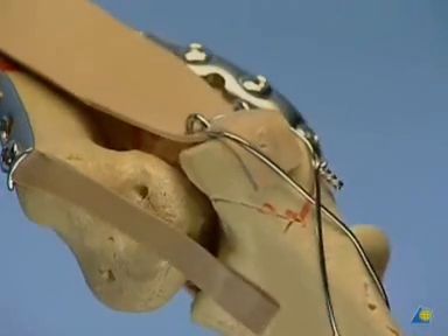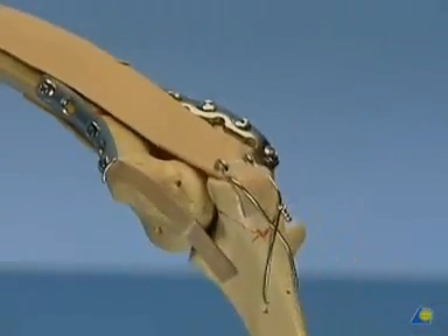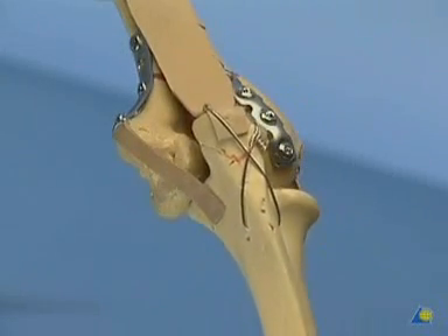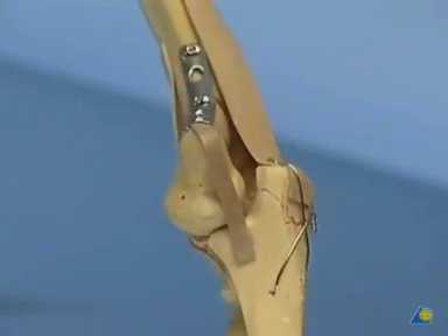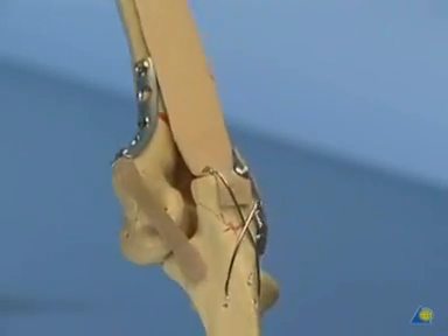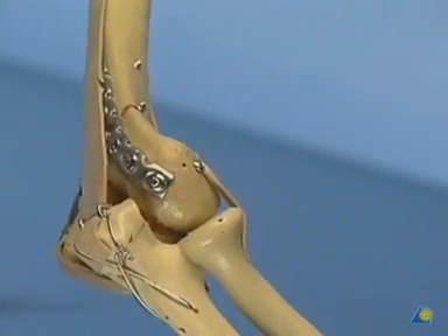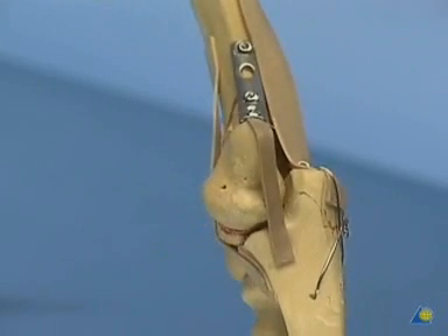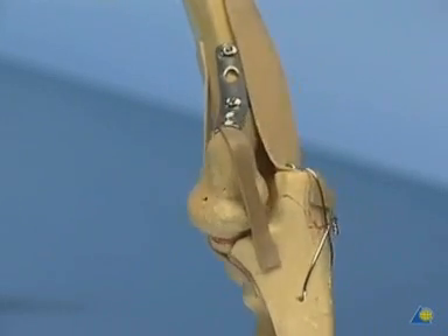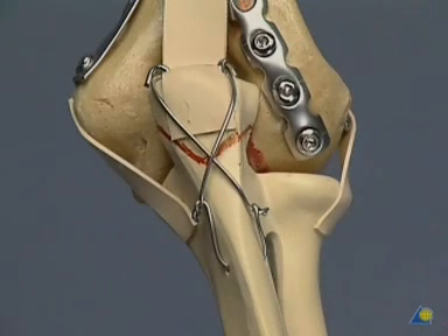The final aspect of our open reduction and internal fixation of a type C fracture. With good reduction and good fixation, this arm may be moved immediately; a splint will not be necessary. Another possibility is shown using two twists in order to fasten the cerclage wire in a symmetrical fashion.